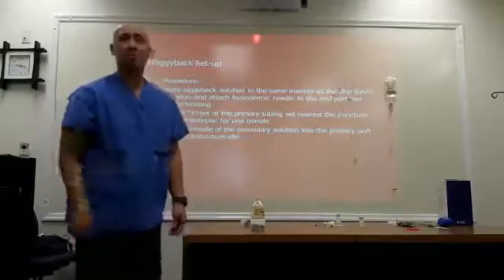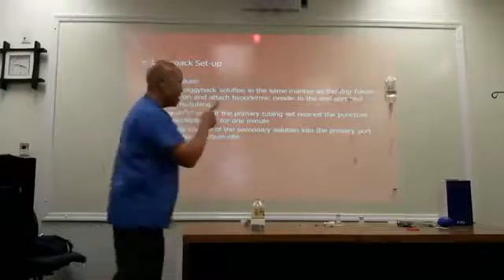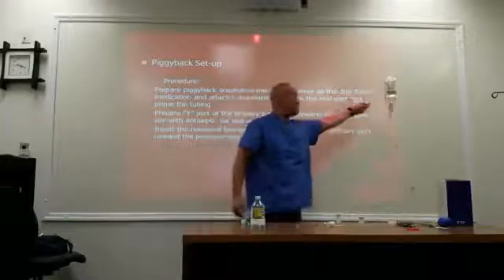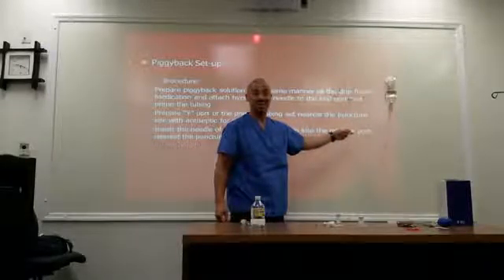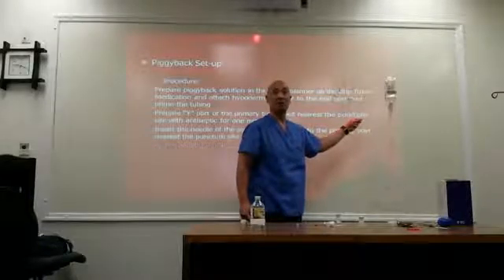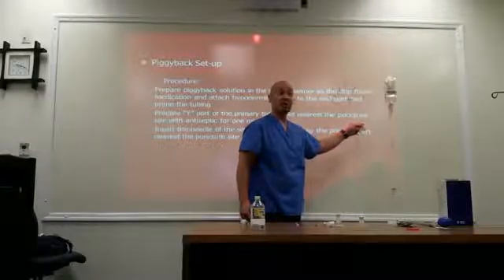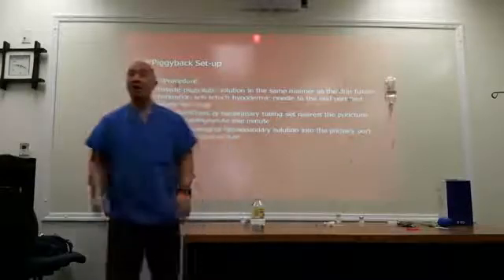You can use any port that you want, but you want to be careful because remember, when I'm injecting through, what am I doing with the main line? Clamping. I'm clamping it off. Make sure that the medication they came down with isn't some kind of life-sustaining medication, because if you clamp this off, you can kill them. They're going to die. So what happens if it is life-sustaining? If it's life-sustaining, then you leave that alone and start your own. You insert your own. You start another one.